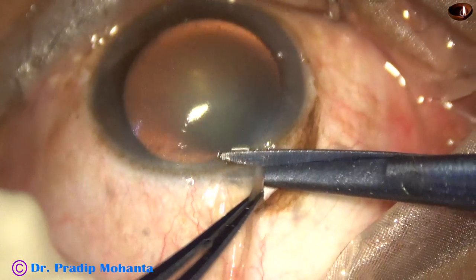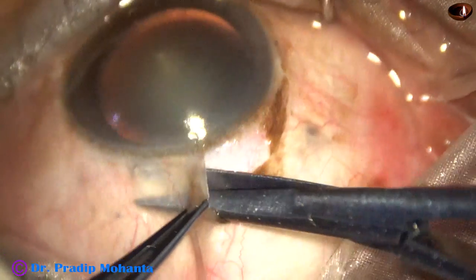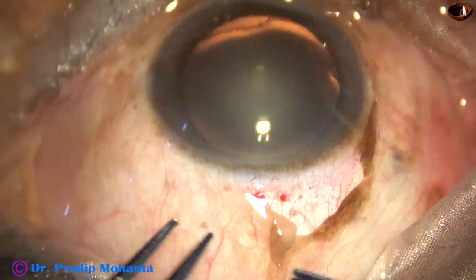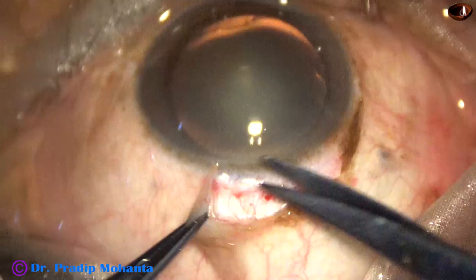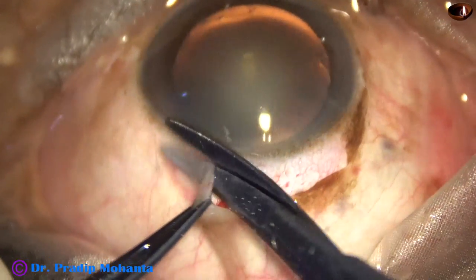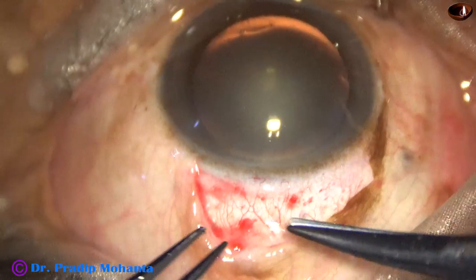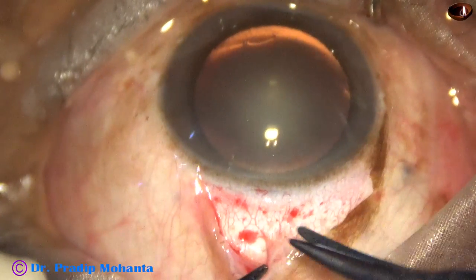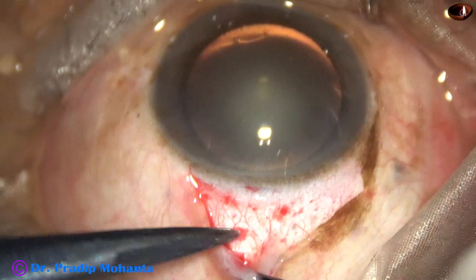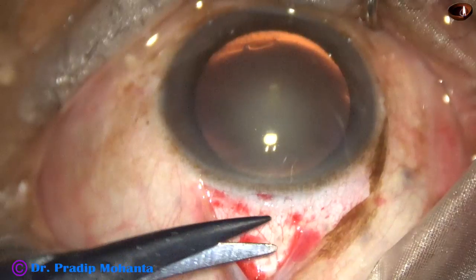After a small radial cut, conjunctival peritomy is being done for three o'clock hours — approximately two and a half to three o'clock hours, from ten-thirty o'clock to one o'clock.